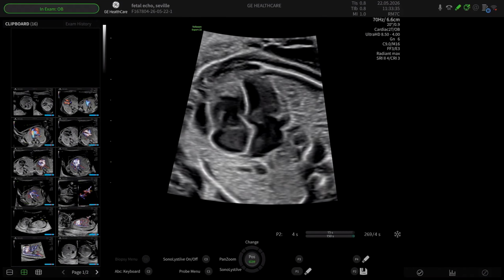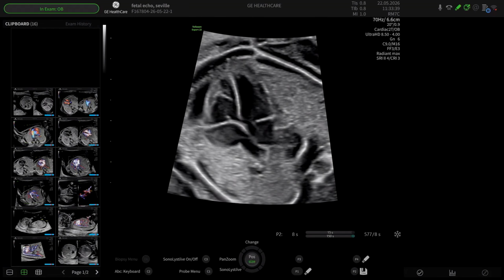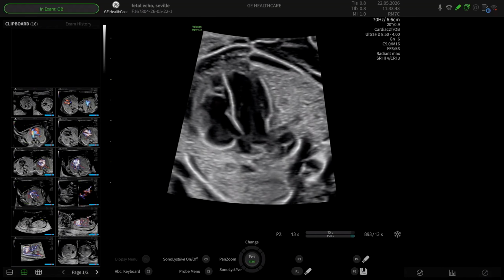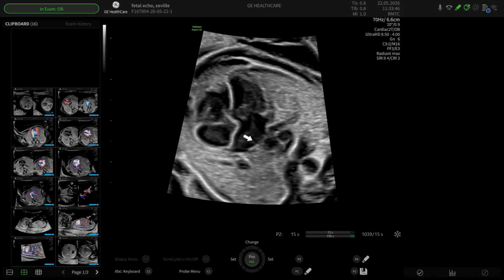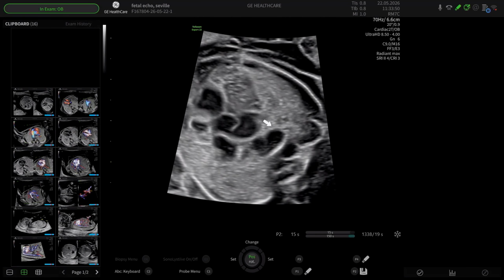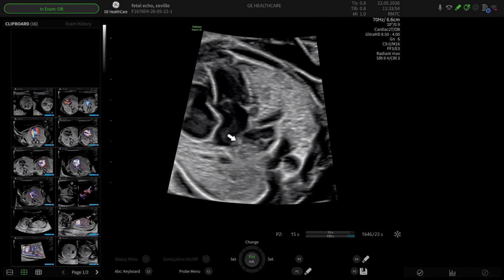It's more that we say in routine screening in the ISUOG guidelines, if you see one pulmonary vein coming in, you've excluded total anomalous. Yes. The problem is on 2D, if you see a pulmonary vein coming in here, then you have to move slightly inferiorly to try and catch the other pulmonary vein, or superiorly, and it's very, very difficult to do that.